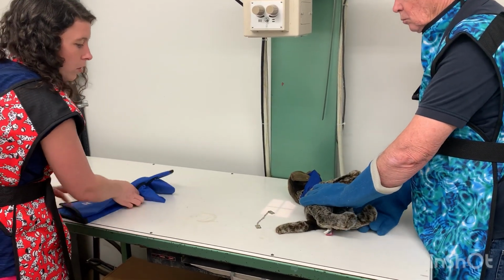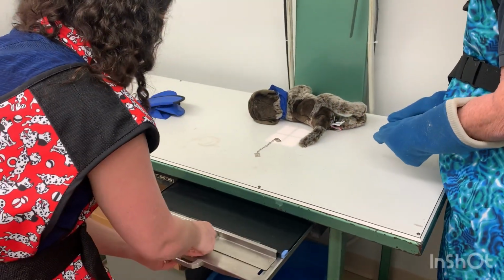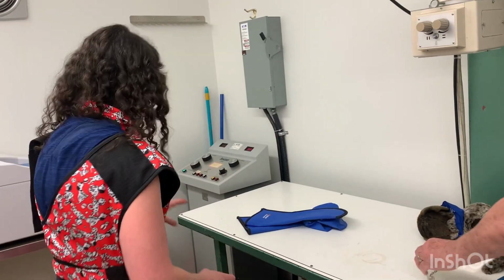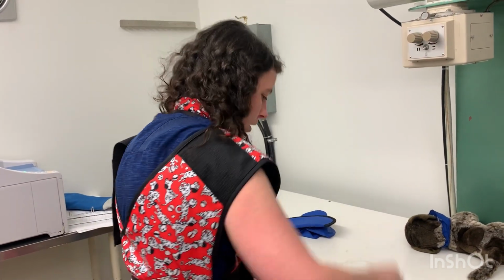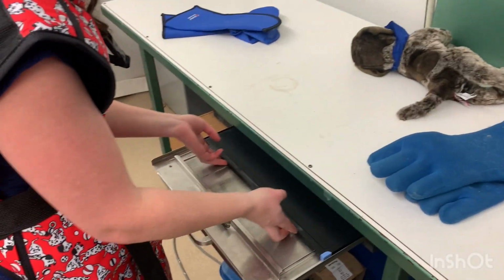Now I need to take our PSP plate out because the latent image is now stored in it. We're not going to be taking any more radiographs right now, so I can turn off the collimation as well. And then we're going to take our PSP plate out.